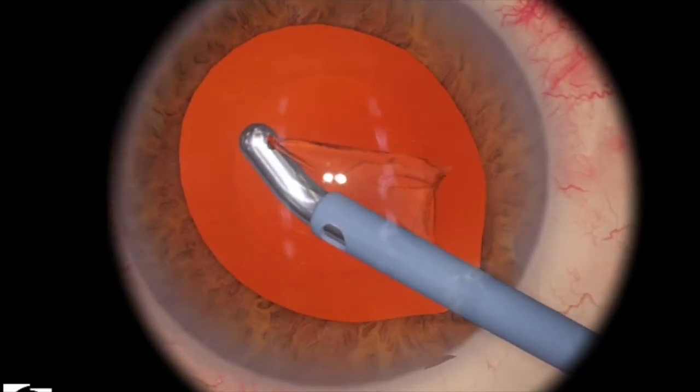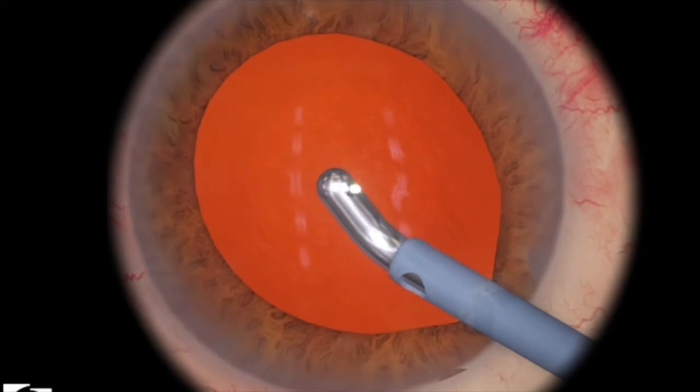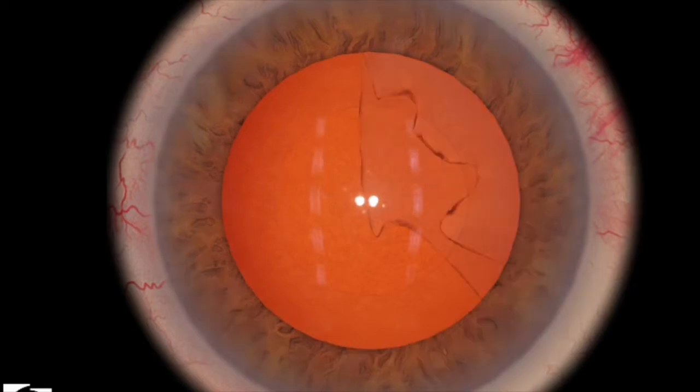That way you're not really engaging the anterior capsule as much as possible. Here I've cleaned up most of the capsule very nicely, and then I can just come out because the machine is already set on continuous irrigation.